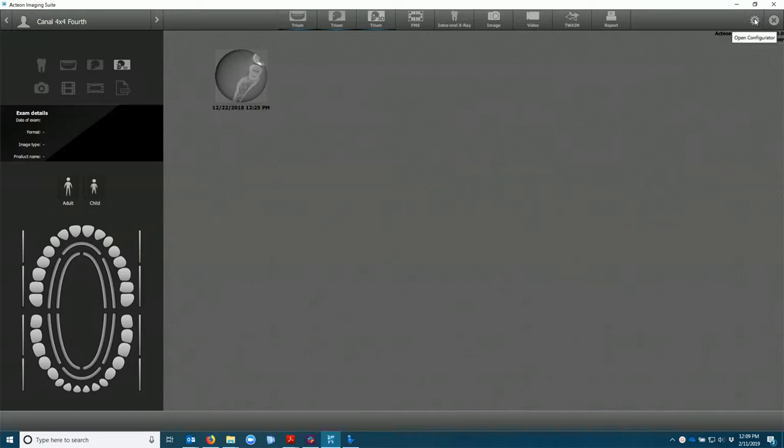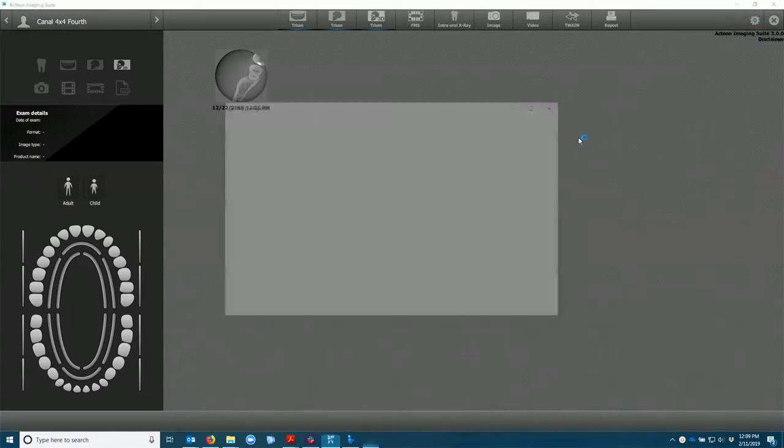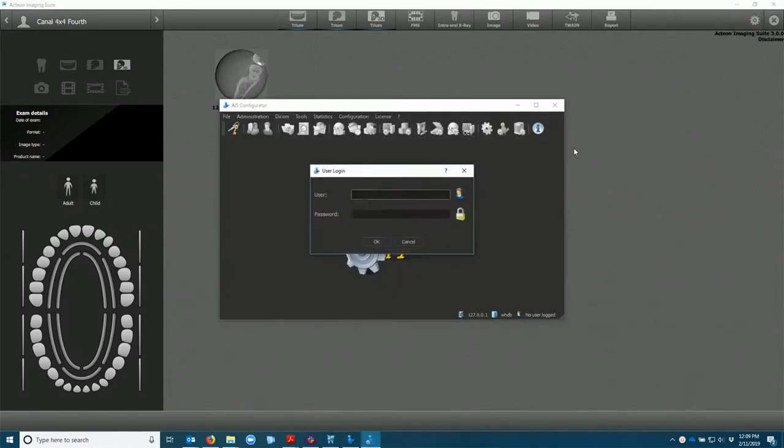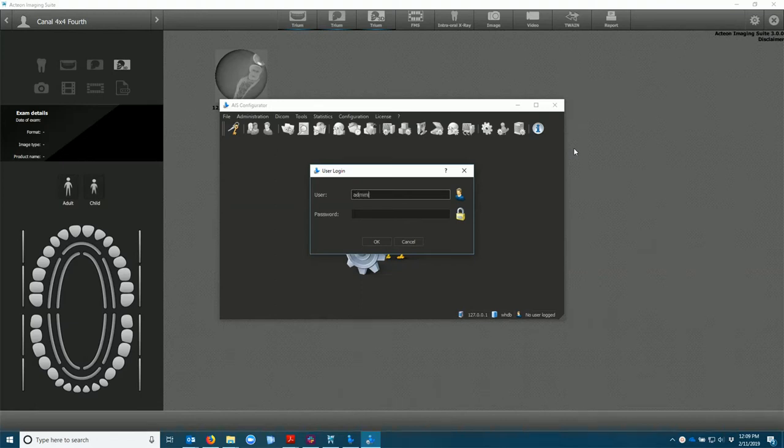We're going to open the configurator. Username is administrator. Password is the same.